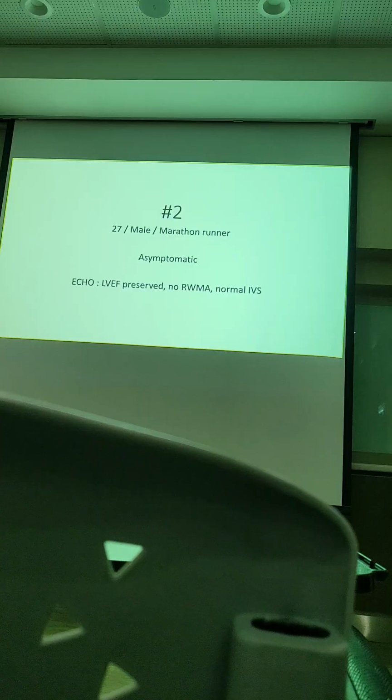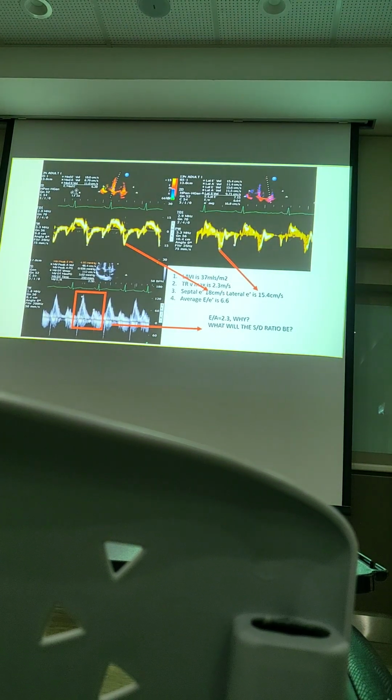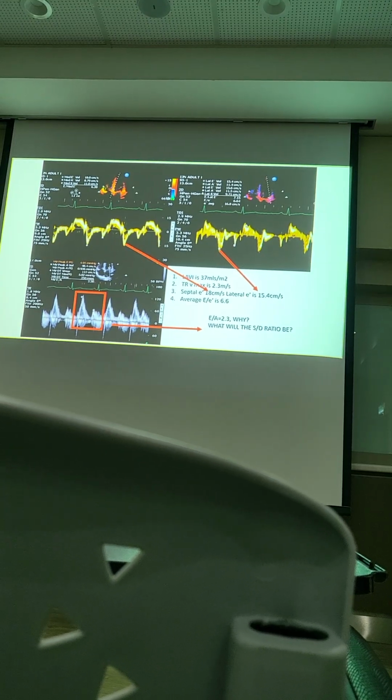Okay, second patient, 27 years old, male, marathon runner, asymptomatic, buat echo. Kenapa buat echo lah? Itulah, patient VIP kot kan. Okay, so buat echo, initial echo okay, and then buat diastolic assessment. Macam mana? Mana yang okay, first sekali, okay, ignore the EA ratio. Okay, ni okay tak? The 1, 2, 3, 4, mana yang tak okay? Boleh tengok font tadi kan, tadi tak ada gambar kan? Okay. Nah, hafal memang susah pun. Ada tak yang tak normal kat dalam sini?